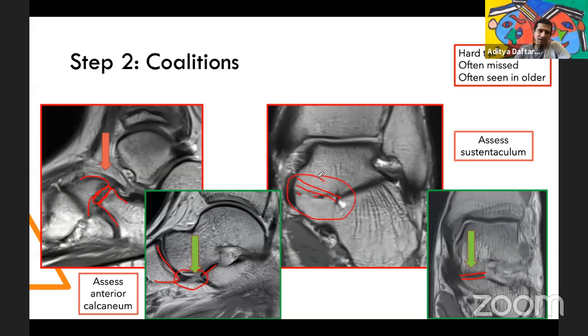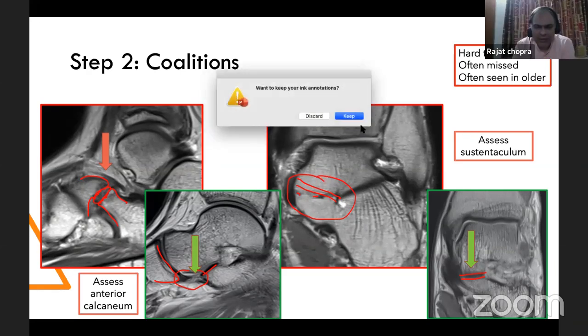And this is something that you can oftentimes see better on CT, and these are situations where I think orthopedic surgeons prefer CTs because it gives them a better sense of how much is bone and how much is soft tissue. That's just your way of thinking. You're trained to look more at CTs, because you can tell bone from soft tissue in black and white. And with CT, you can potentially create 3D models now. You can do a bunch of other things that can help you.